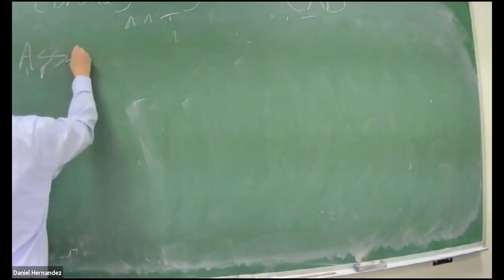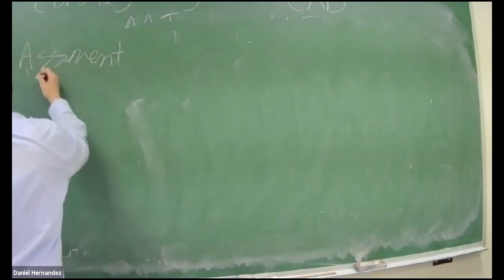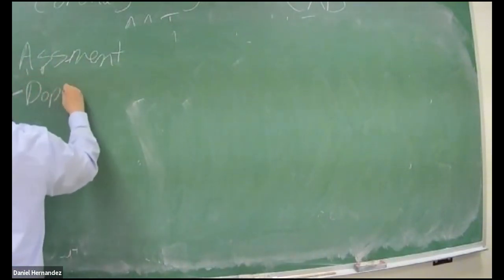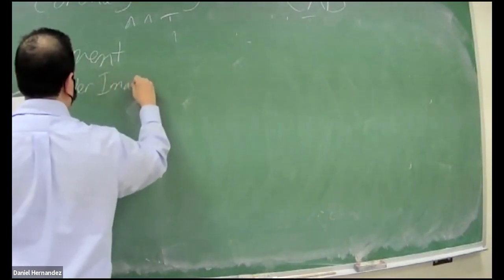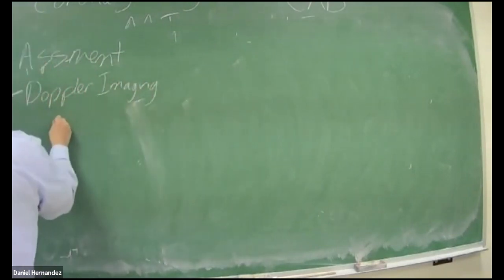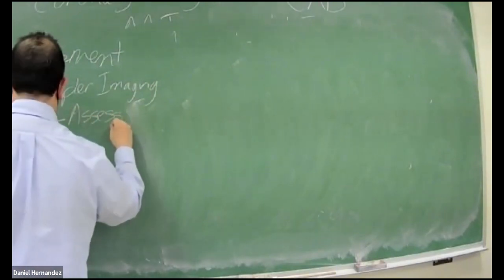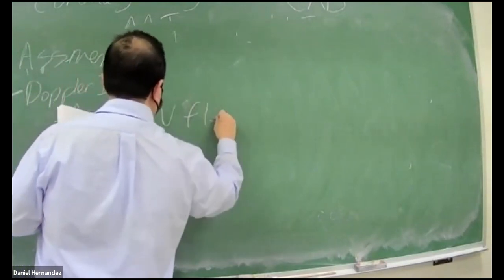So assessment. We're going to do Doppler imaging. We assess the mitral valve flow pattern.